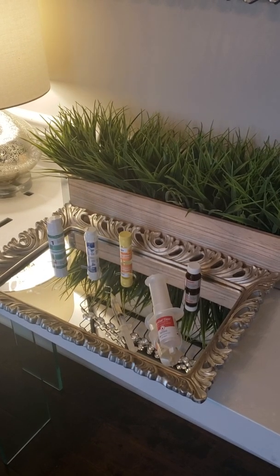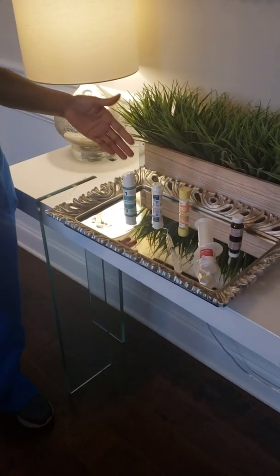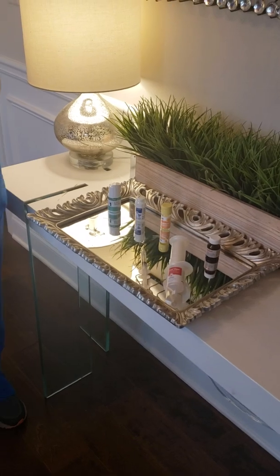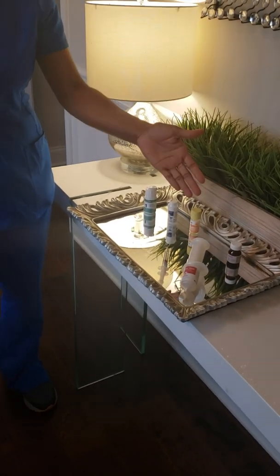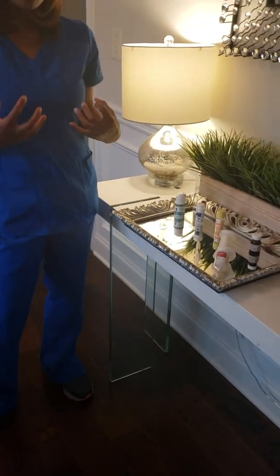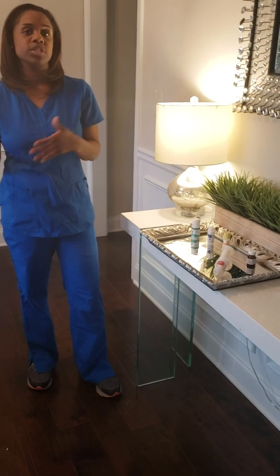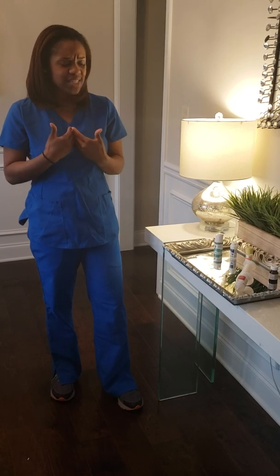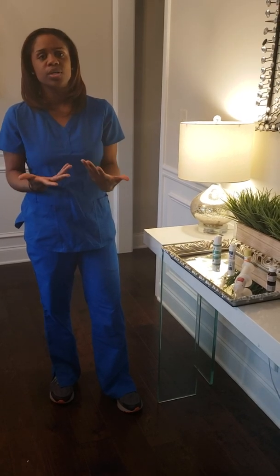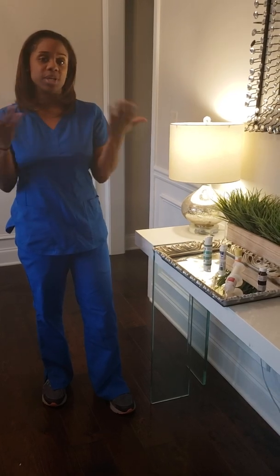In this segment, what I want you to take away is that there are different types of cords that we have used in the dental field. All the different brands are very, very good brands. Hemodent is something that we use to decrease the bleeding, and Viscostat is another agent that we also use to decrease the bleeding. They're both very good. Doctors love it as well. As an assistant, I just want to use whatever's easier and make my doctor happy, so we can go through the process a little bit easier.